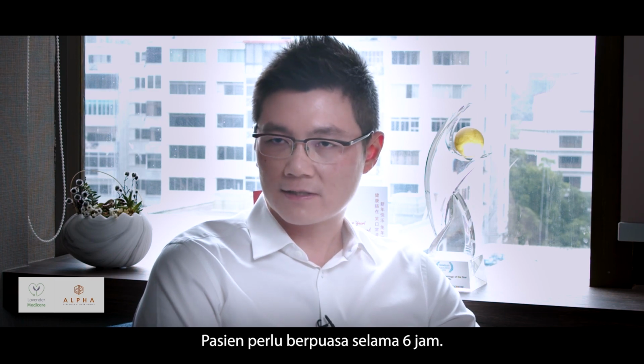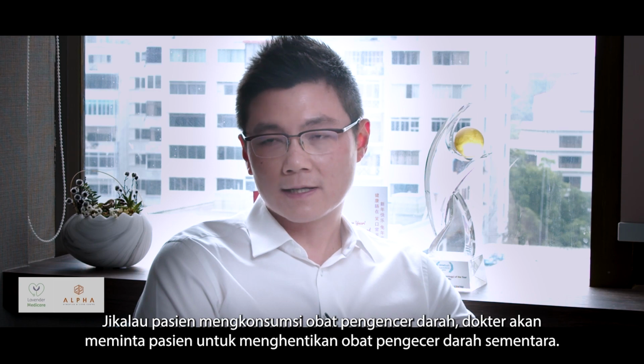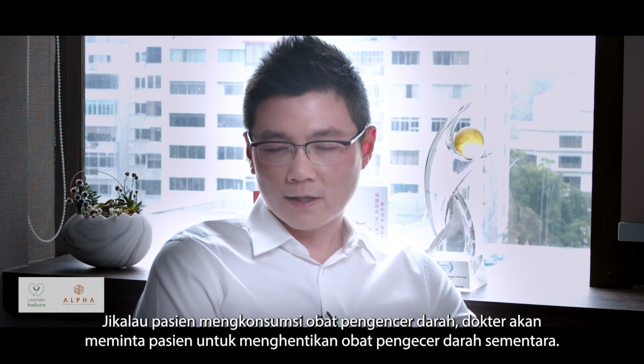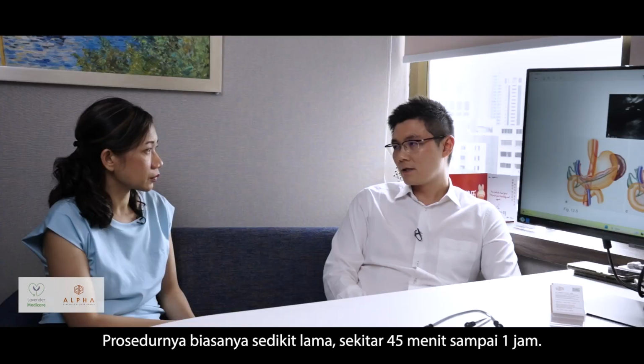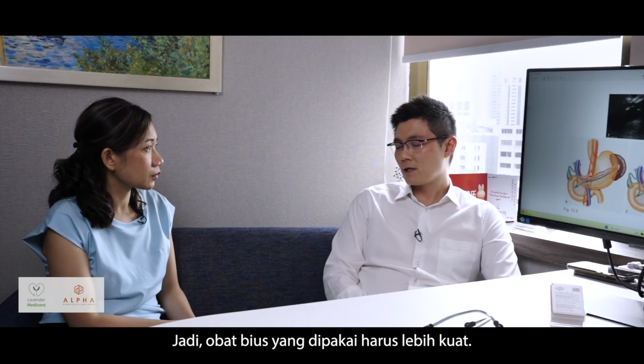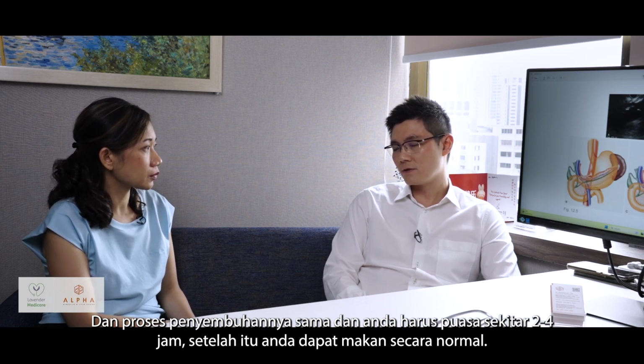The patient will need to be fasted for 6 hours. If the patient is on blood thinning medications, the doctor may ask the patient to stop for a while, and the procedure usually takes a bit longer, about 45 minutes to an hour. So the anesthesia or the sedation may have to be a bit stronger. And by and large, it's the same recovery, and you may have to fast for 2 to 4 hours after that, and then you can resume your normal diet usually.